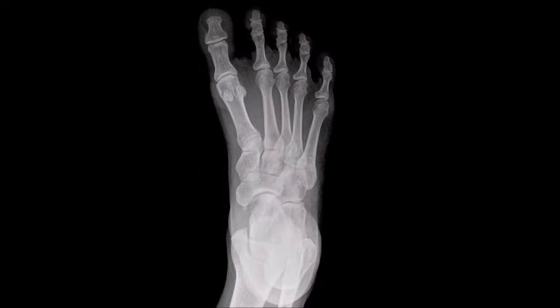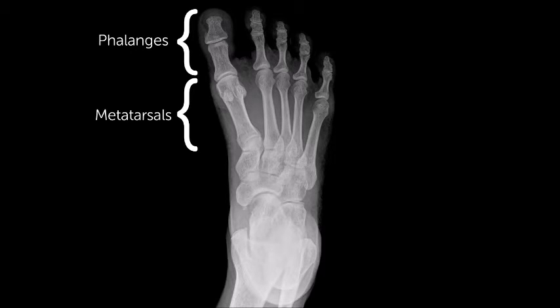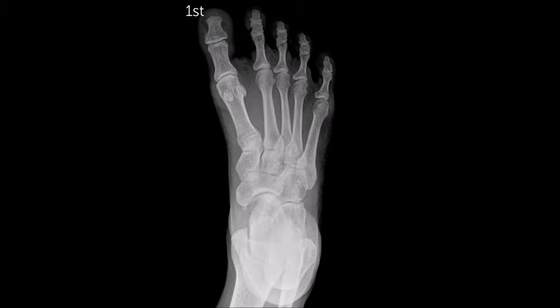We'll begin with an AP projection of the foot. We get good visualization of most of the bones of the foot here. However, those most proximal tarsals have some overlapping of the tibia and fibula. The digits are numbered first through fifth, starting with the great toe.